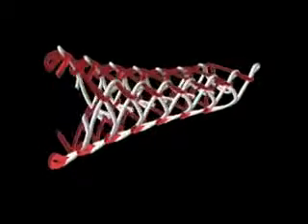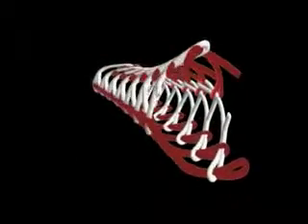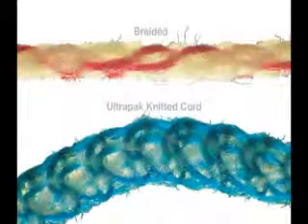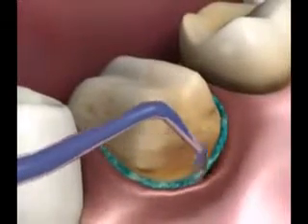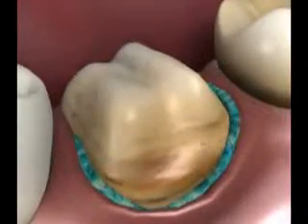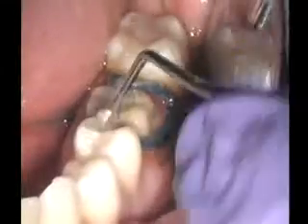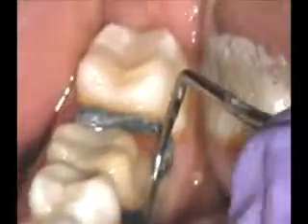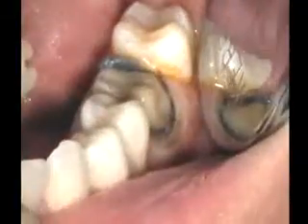ULTRADENT's 100% cotton cords are knitted into long chains of microscopic interlocking loops. At first glance, these knitted cords may appear too large. However, the interthread space of the knit cord allows for easier compression and packing, and can carry a considerable quantity of hemostatic retraction solution in comparison with braided or twisted cords.